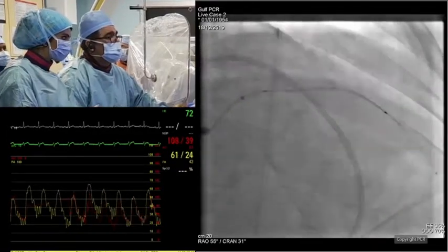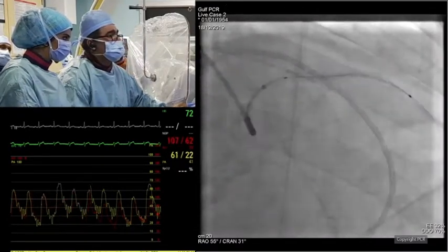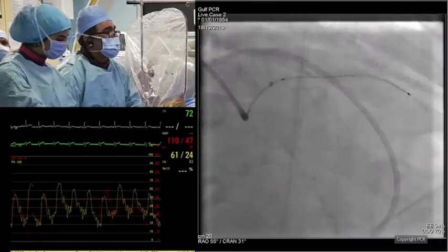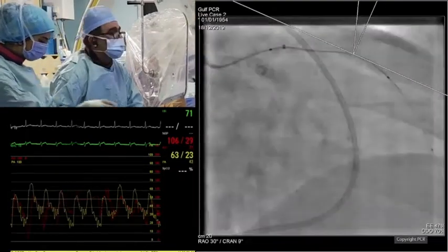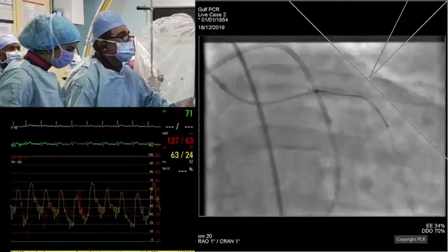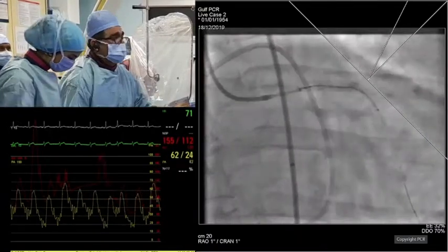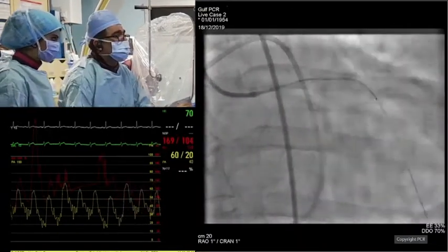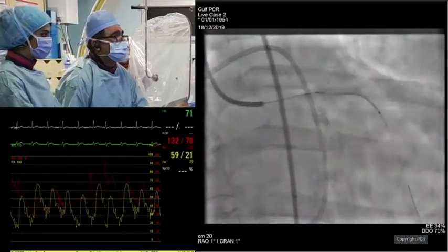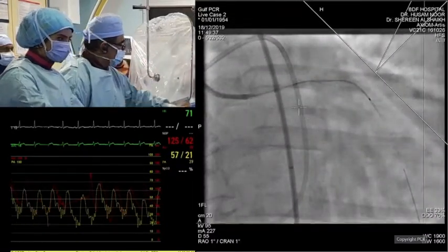I think, Dr. Subhi, because of the presence of OCT imaging, which is such a high resolution image, I don't think in the LAD you would need the FFR. I don't know. What do you think, Khafir? There is new data on iFR showing that pullback iFR post-stenting has shown that 1 out of 3 or 1 out of 4 are still ischemic by the time you put your stent. Yes, there's residual ischemia. Last week in JACC, there was residual ischemia following stent optimization. So you need to have another FFR to see that, to improve optimization apart from OCT as well.